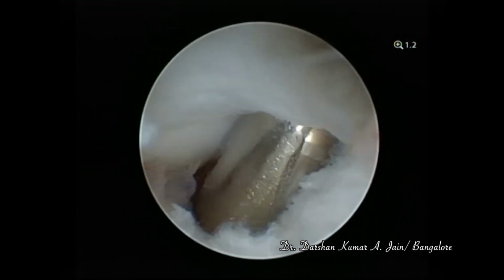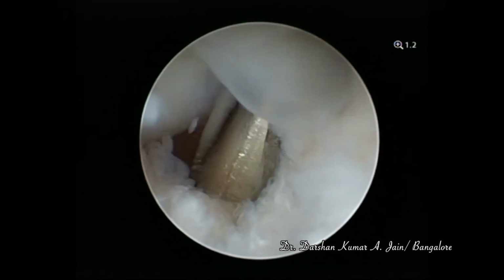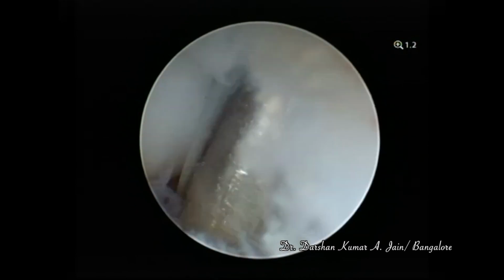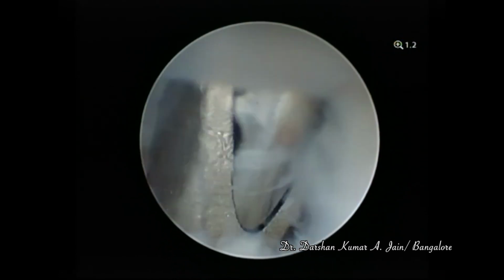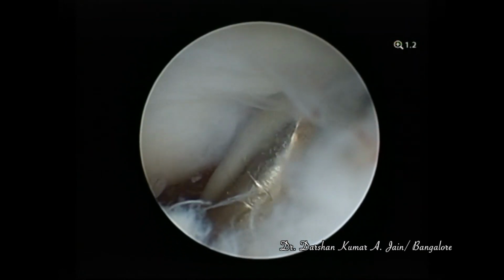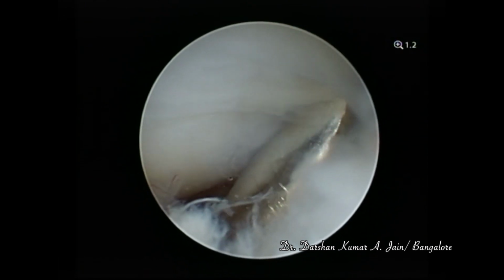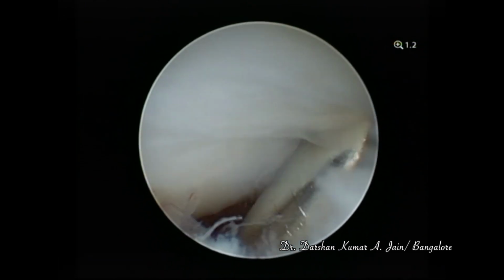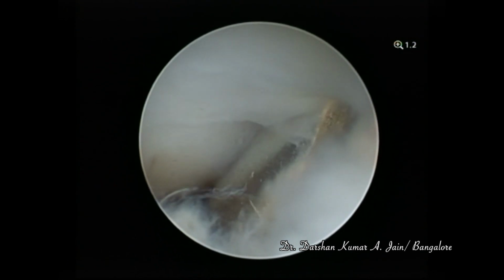And now as soon as we go near the cyst, the pedicle is shaved off, and this is visualized as a change in the consistency of the fluid, which is seen as floaters or some turbulence in the fluid there. Or else this is much better visualized if we are doing a dry arthroscopy.